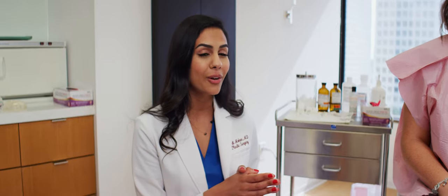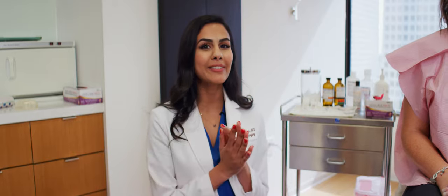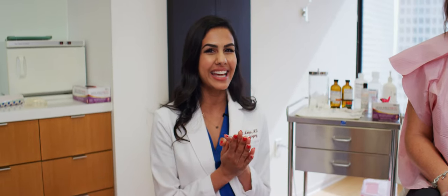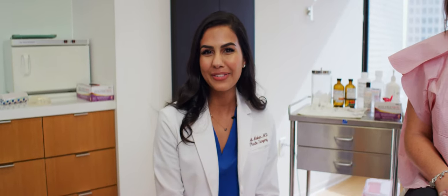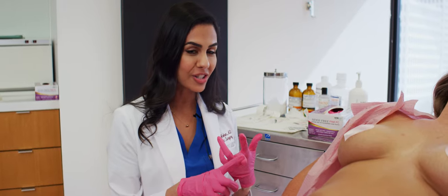It sounds super scary, so we thought we would film a little video describing the process because it's super easy and done in office. I have a lovely lady with me today who graciously allowed us to film that for you. We can do it under local in the office, which means no anesthesia — you're awake and very comfortable during the procedure.